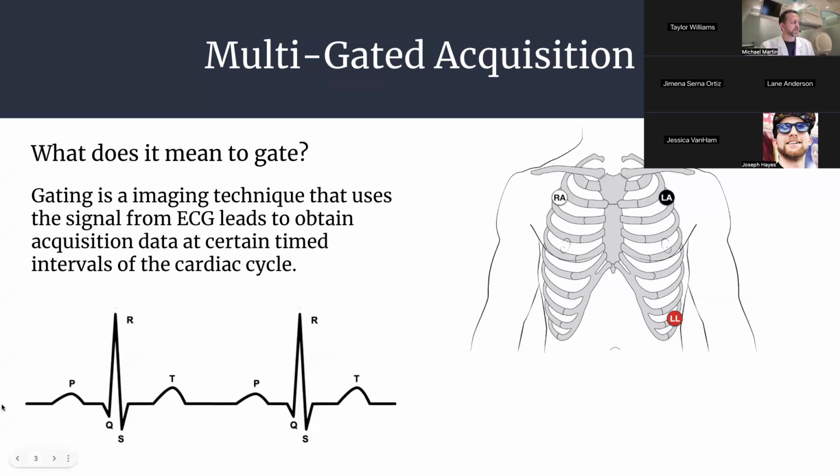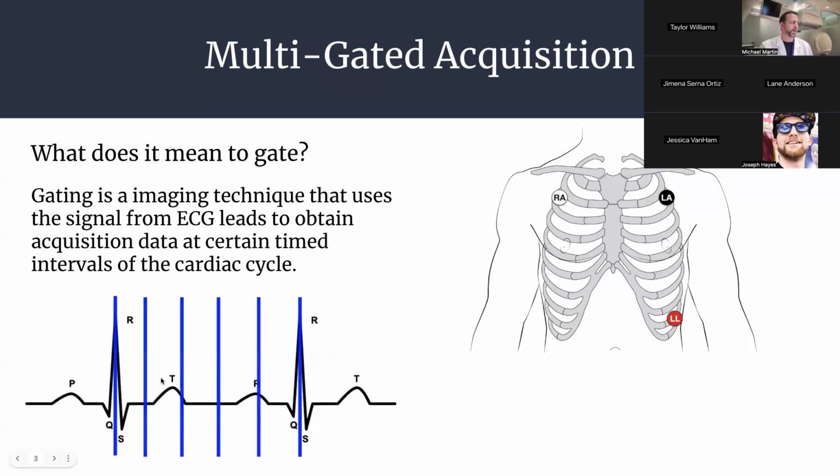And what I've done with this cardiac cycle, remember, we talked about the cardiac cycle and the R to R interval last time, right? And that's an important interval. But you've got your P, your Q, R, S, and your T that we learned about. Essentially what I've done here is I've drawn lines from R to R. So what your camera is going to do is when you hook up those EKG leads, it's going to look for that R to R interval. It wants to find that highest peak, which is typically your R wave. And it's going to say, okay, here's my set standard of what I'm looking at.